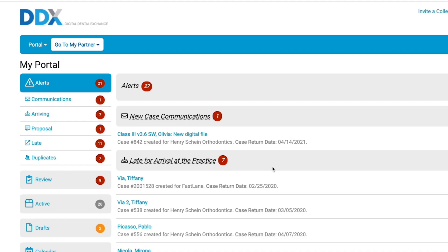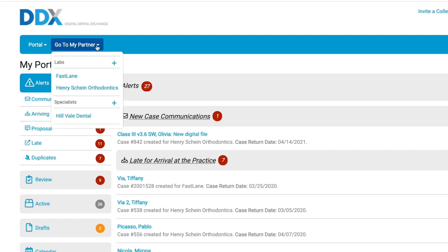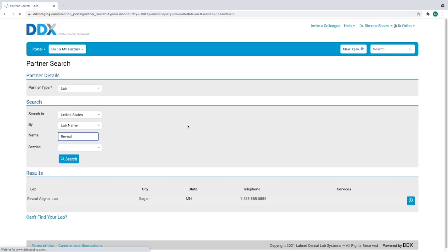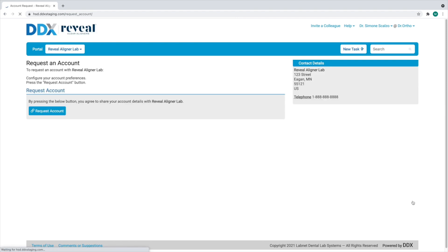In the top DDX menu, click Go to My Partner. Click the plus symbol next to Labs. Enter Reveal in the name field and click Search. When the Reveal Aligner Lab is displayed, click the button on the right. And then click the Request Account button.